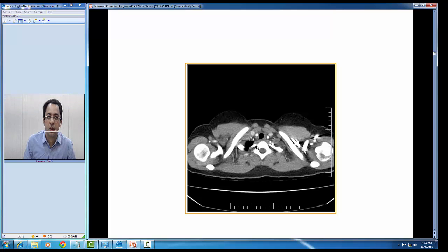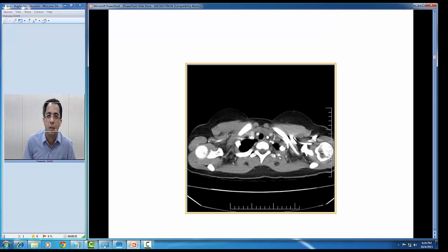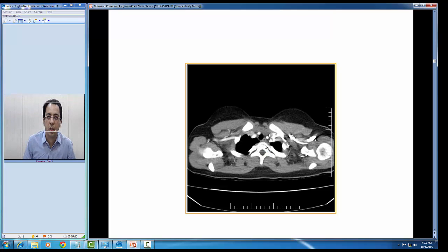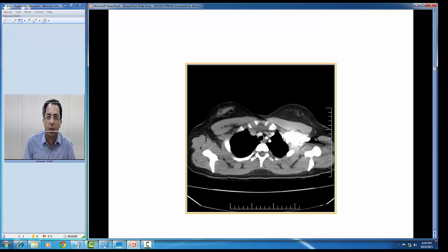You can see the ribs, the thoracic vertebra, the clavicle, the glenoid, the scapula, and the humerus at the glenohumeral joint. Going down, we can see the thoracic vertebra with ribs articulating with it.